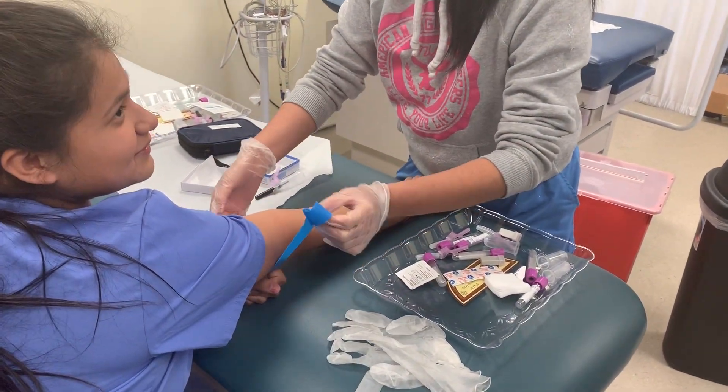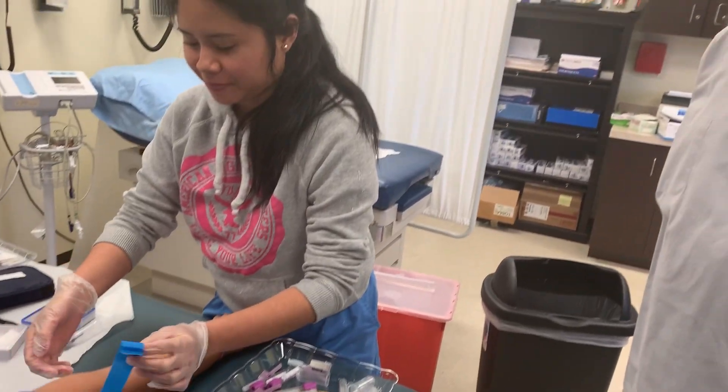Hi, good morning. This is Dr. Modi. My MA Day class is performing a phlebotomy procedure.